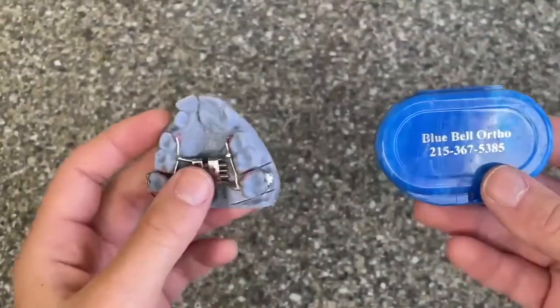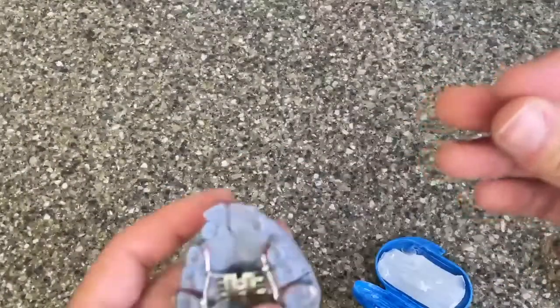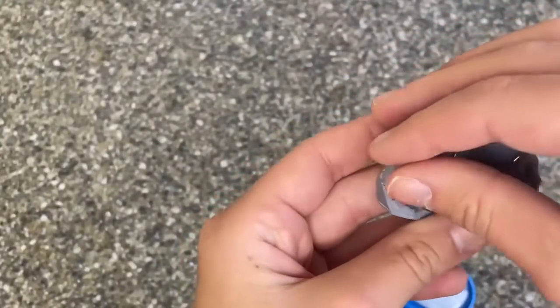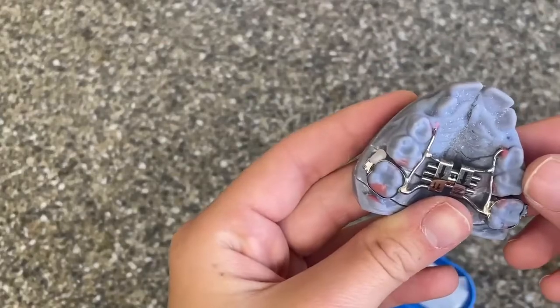If anything is ever bothering you on your expander, you can take a little piece of wax, roll it up into a ball, and place it on the area that is affecting you. The secret to this is making sure that the area is nice and dry before putting the wax on.